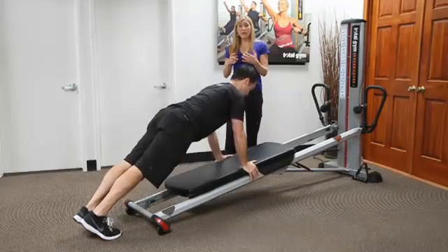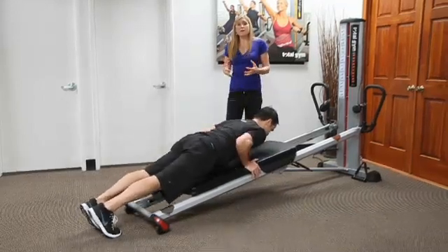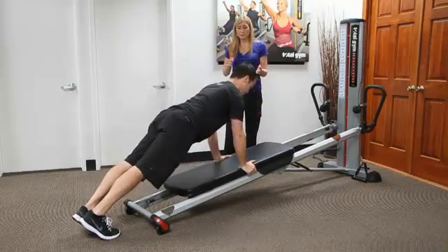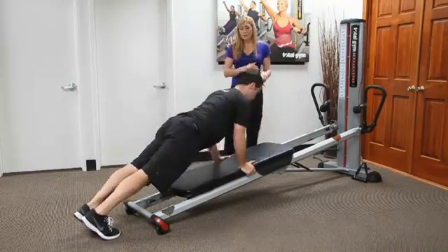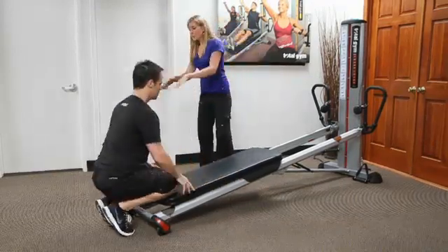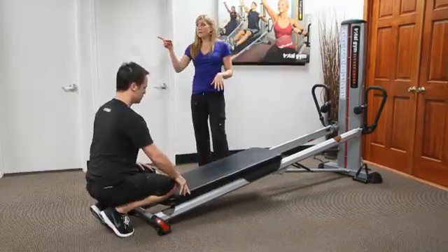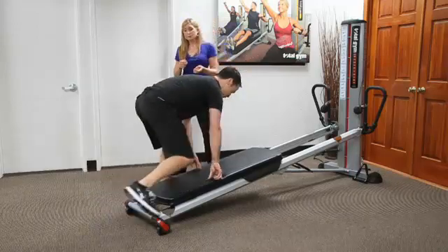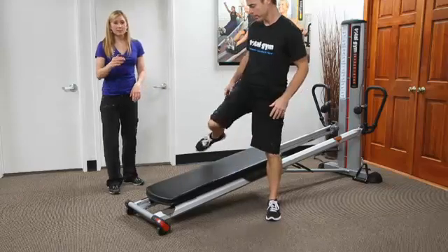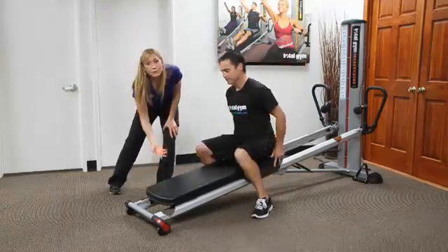So that gives a lot more feedback if you might be moving or tweaking or compensating some way, and it makes it a lot more challenging. So going with this concept of open, you can slowly come back. I'm going to have you straddle, push the board up, and take a seat at the bottom facing away from the tower. So you're going to go the other way. We're making it realistic for you. There you go. Push up, and you're going to go into what we call a roll up.